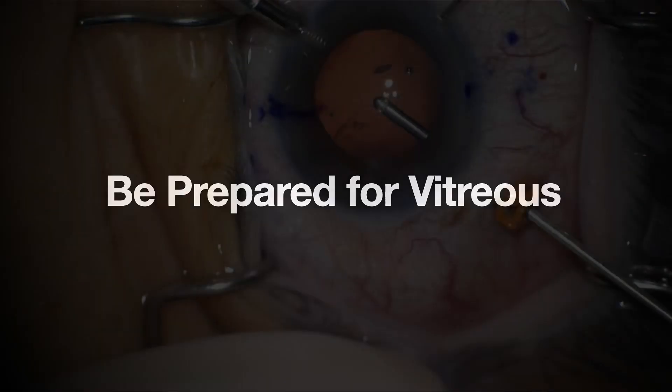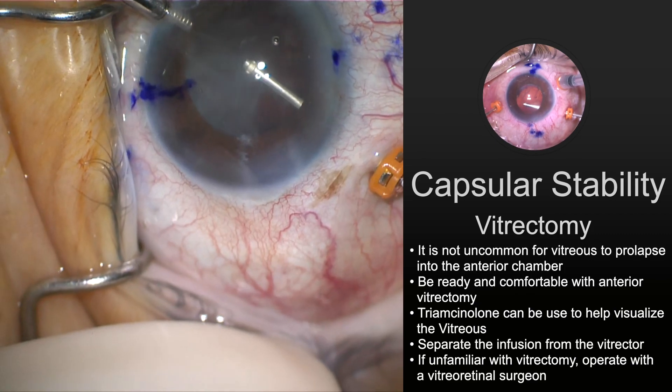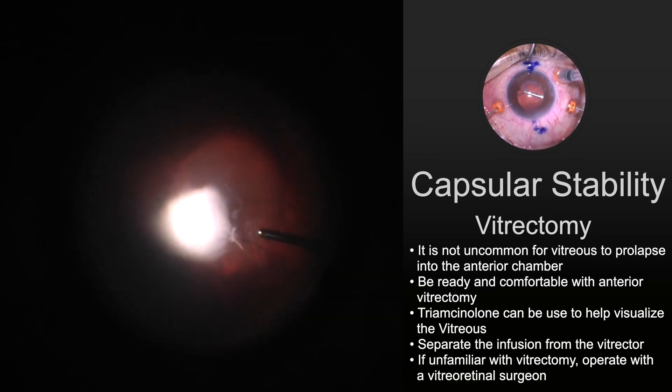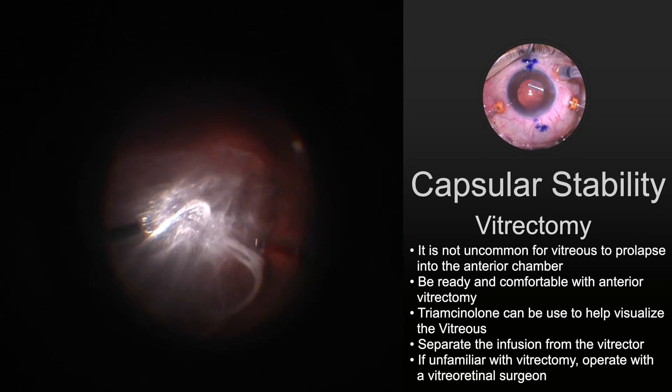Last but not least, when you have loose zonules, you have to be ready to do a vitrectomy. It's not uncommon to see vitreous prolapse in these cases, and you have to be ready and comfortable with the anterior vitrectomy. Definitely use Triamcinolone. Separate the infusion line from the vitrector. And if you're not comfortable doing a vitrectomy, maybe operate with a vitreo-retinal surgeon.